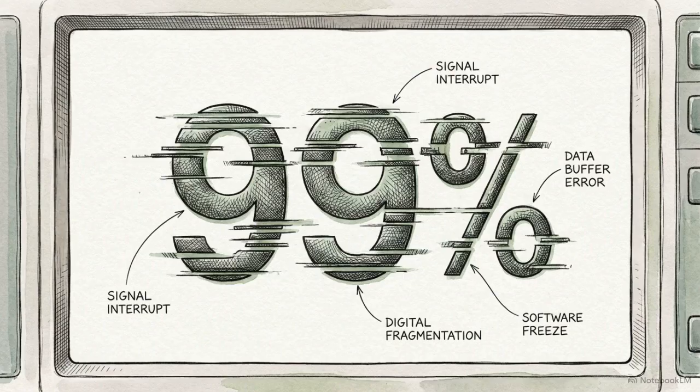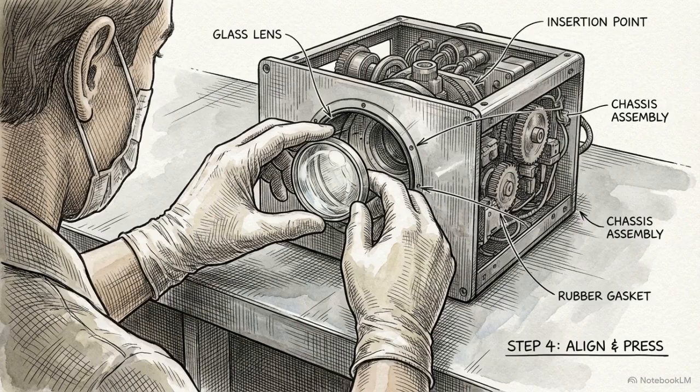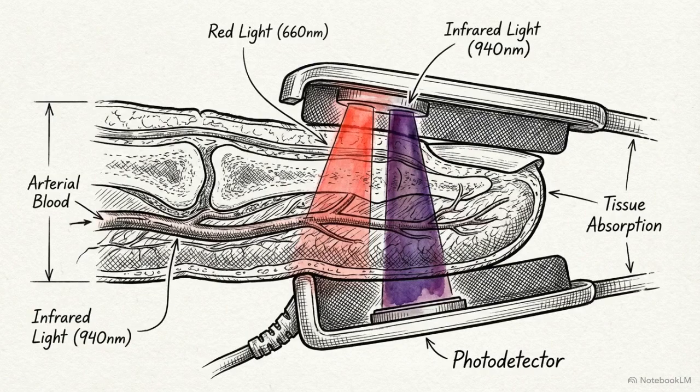To understand why the pulse oximeter lies during a toxicological emergency, we must examine the physics of light absorption and why mastering the physical engineering of the co-oximeter is the only way to recognize its clinical necessity and structural limitations. A standard pulse oximeter operates by emitting exactly two specific wavelengths of light through your finger: red light at 660 nanometers and infrared light at 940 nanometers.